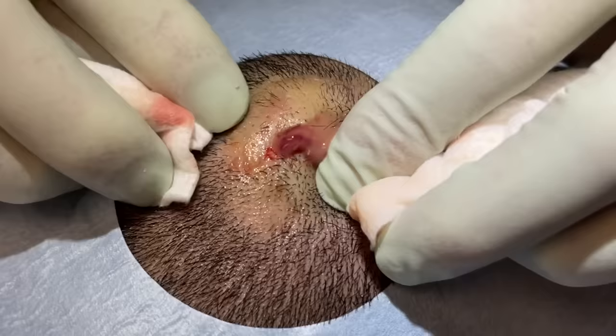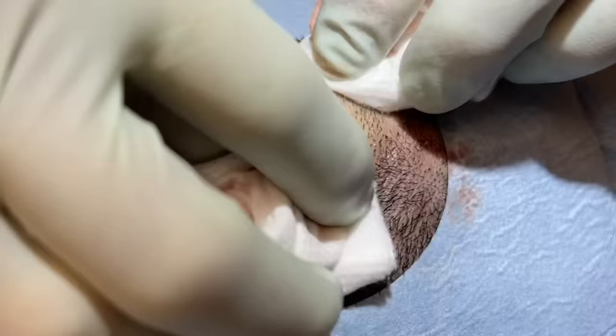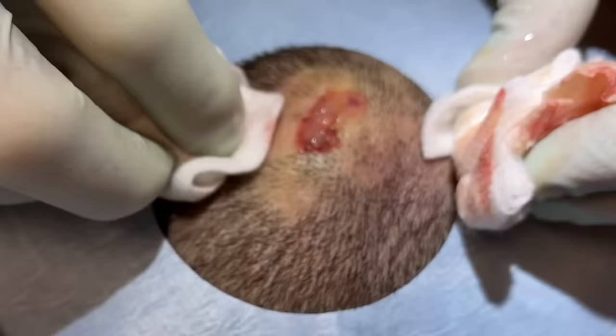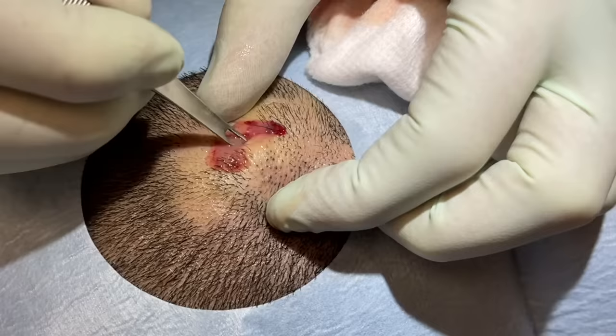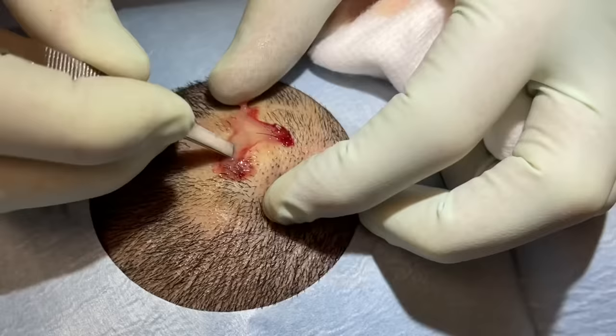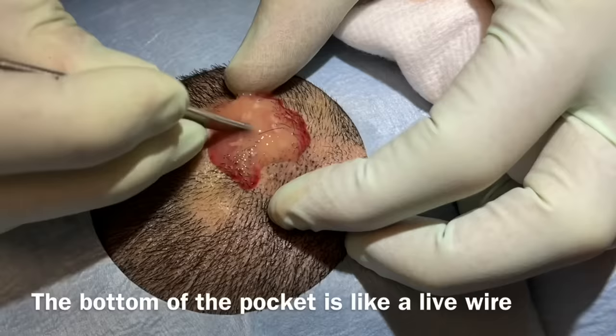You can see there's a lot of pockets in here, so we're getting some fat tissue. He's pretty numb — not feeling a lot — but you can see some of that tissue protruding through, like a little bit of fat tissue here. There can be what's called loculations, which are little pockets in there. I'm using something not sharp; it's blunt so it shouldn't hurt. Many uses of a loop extractor here. Tell me if you have any pain. If I hit the bottom, he'll feel it — that's why I don't go deep.